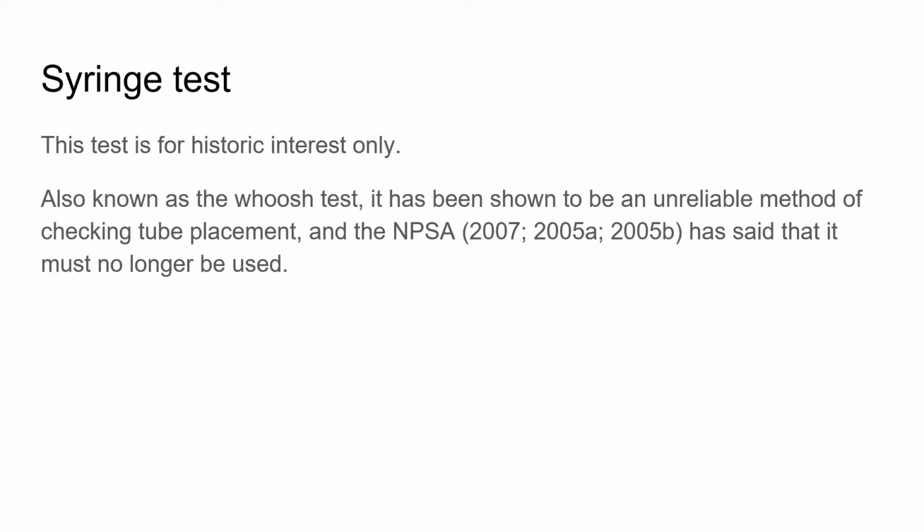Syringe test. This test is mentioned here only for historic interest, so it should not be performed. It is also known as the whoosh test. It has been shown to be an unreliable method of checking tube placement, and the NPSA says that it must no longer be used. So let me just mention what the whoosh test is.